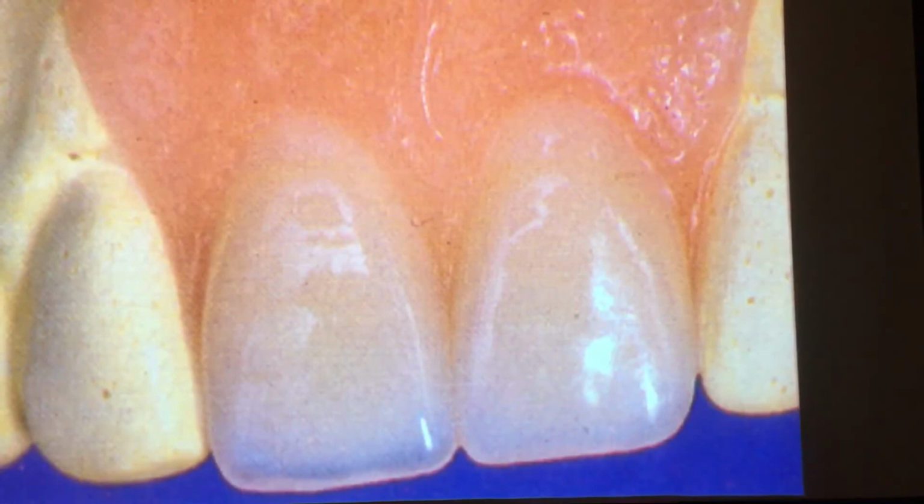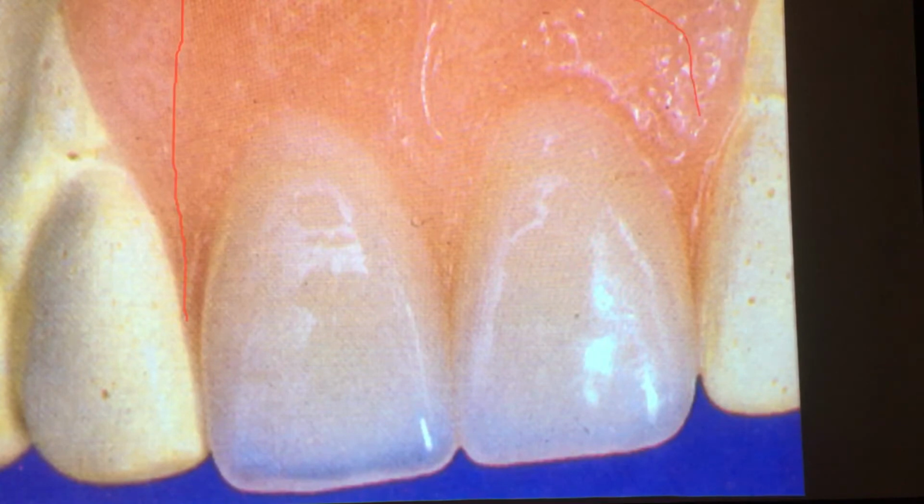Here we have a kind of extreme wax up, and you can see and experience, if this was a transitional acrylic partial denture like we made last year, you know that this will not fit, nor will it come out unless it comes forward towards us. It has to go over these guide planes of 1, 2, and if I just put a red line here, that's the color I have, you can see that we'll be eliminating a lot of this here in this section.